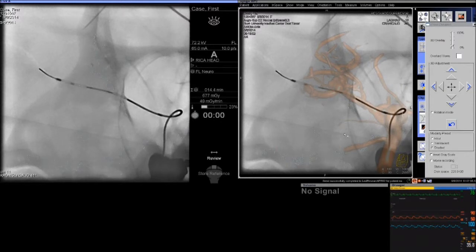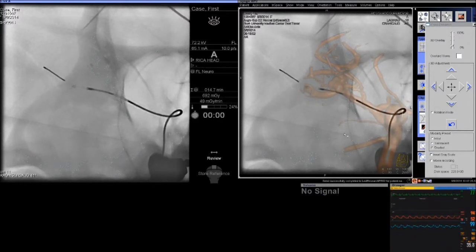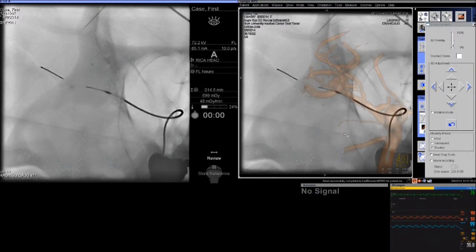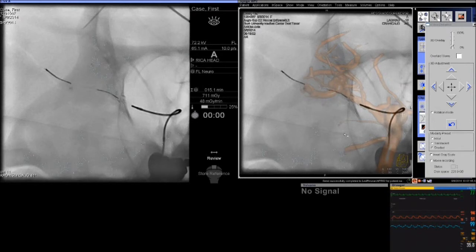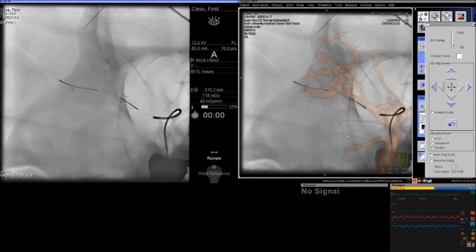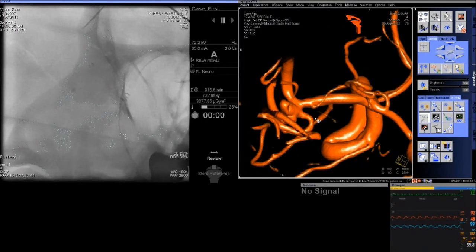As we deploy the second device, we are careful to obtain good distal purchase but very little coverage into the M1, so you don't have extensively overlapping devices in the M1 segment, while still achieving comfortable protection of the aneurysm neck. We chose the same size device as the first — two closed-cell design stents measuring 14 mm each — giving the shortest possible metal segment across the M2 and M1 bifurcation. After stent deployment, the wire can sometimes be caught; you may encounter resistance pulling the wire back and must push forward then back carefully to release it from between the two stents, being careful not to move the Y-stent construct.